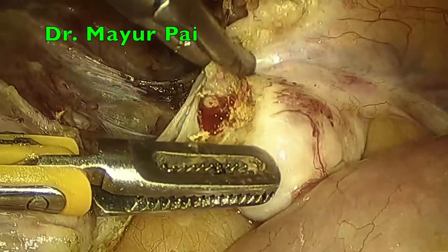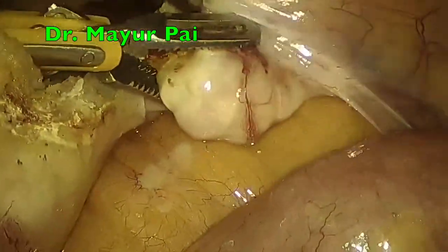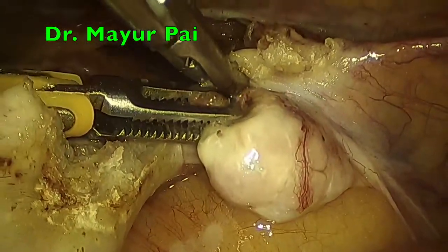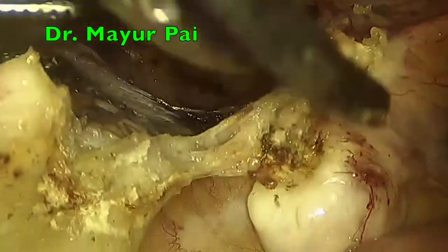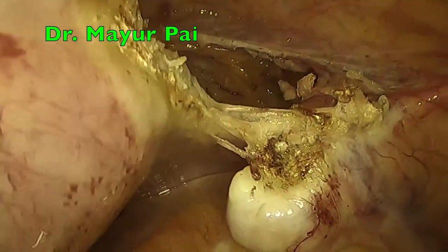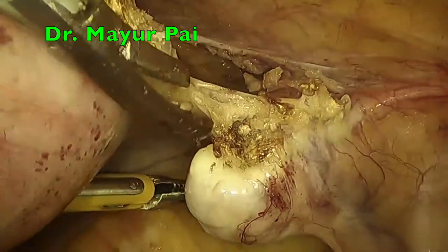You can see a small vessel is being treated with the bipolar forceps. Since the ligament is very short, the vessel has retracted inwards. However, it can be very easily treated using bipolar energy.